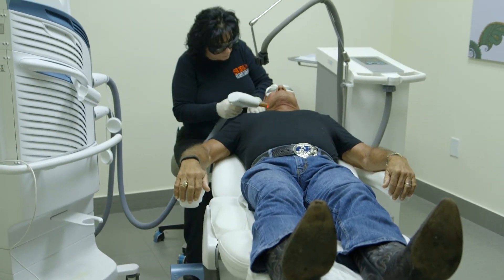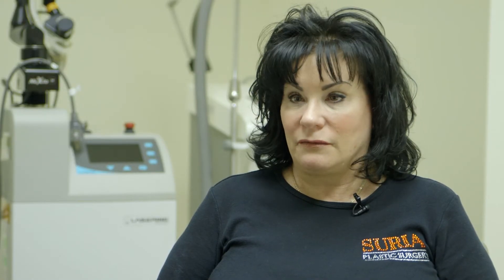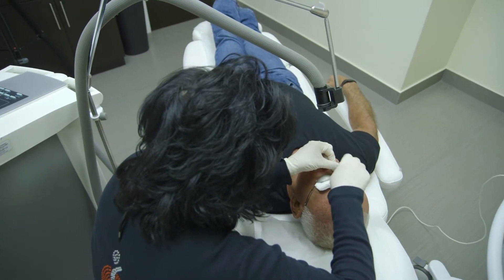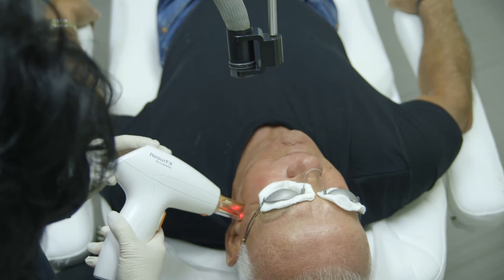The patient's in the chair and they have a topical that they put on themselves for about an hour prior. We take that topical off, we cover their eyes, we put a chiller on their face, and I start the Resurfix.